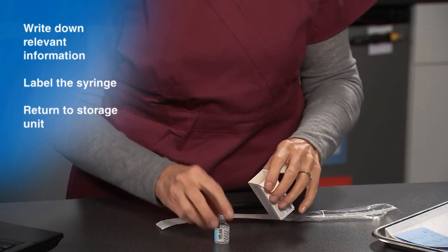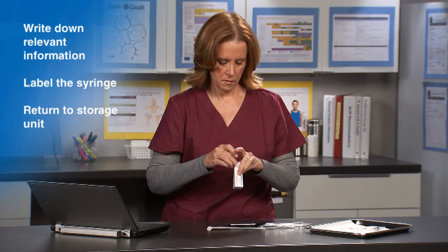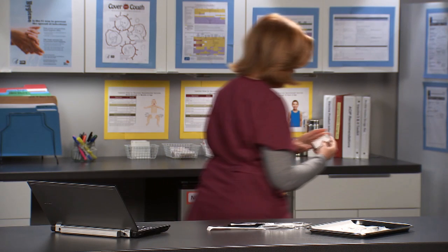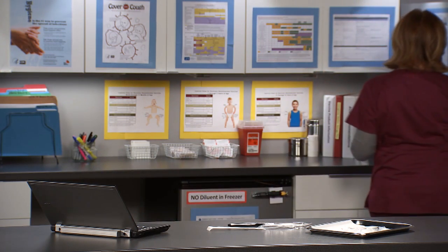Put the multi-dose vial back into the box and return the vaccine to the storage unit. A multi-dose vial should not be kept or accessed in the immediate patient treatment area.